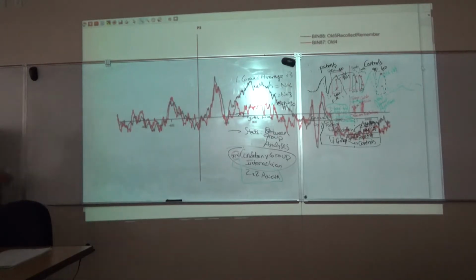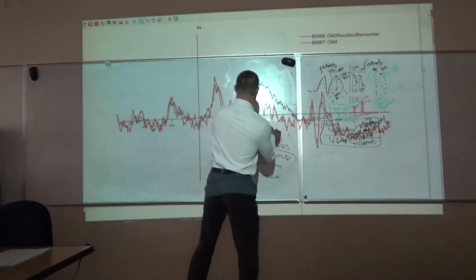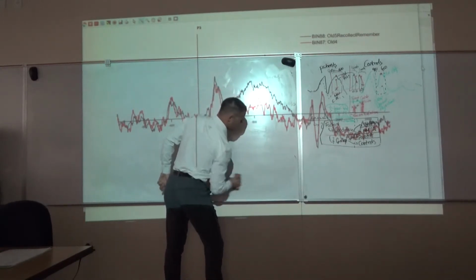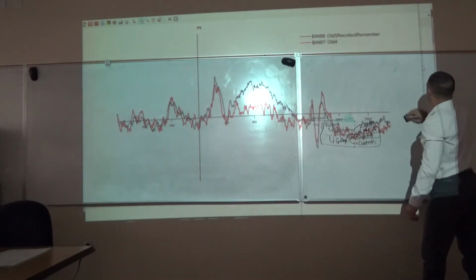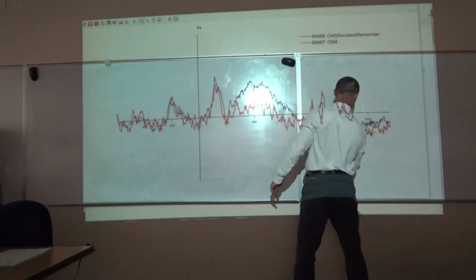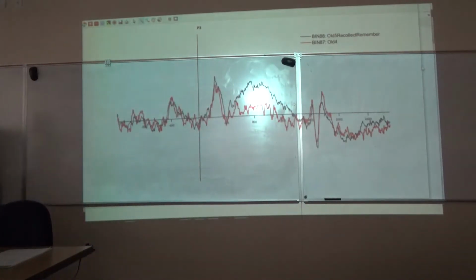Well, how about I erase all this stuff now? I didn't realize this was up here for you guys. Okay, so let's bring this over a little bit to the left. Okay.